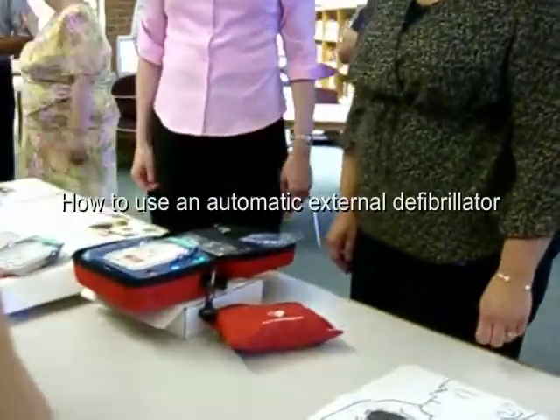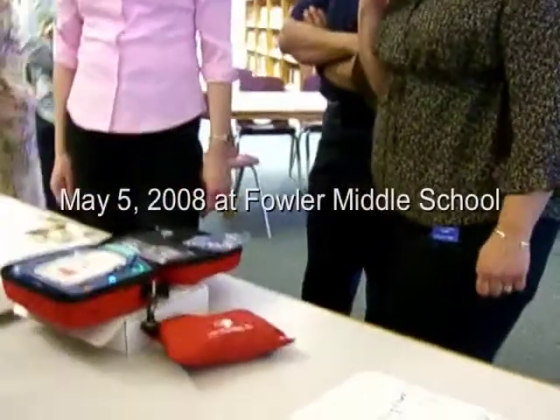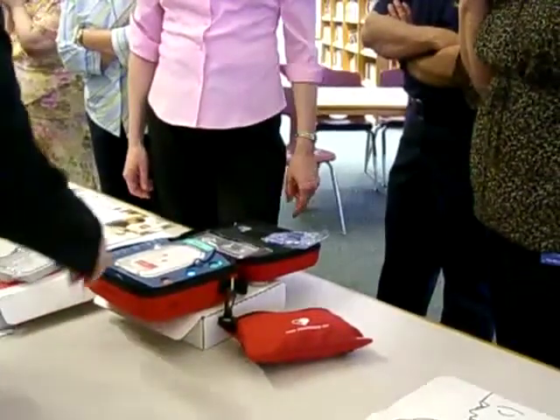In case of emergency, remove the training cartridge and insert the pads cartridge. Press the flashing blue button to choose a training scenario.